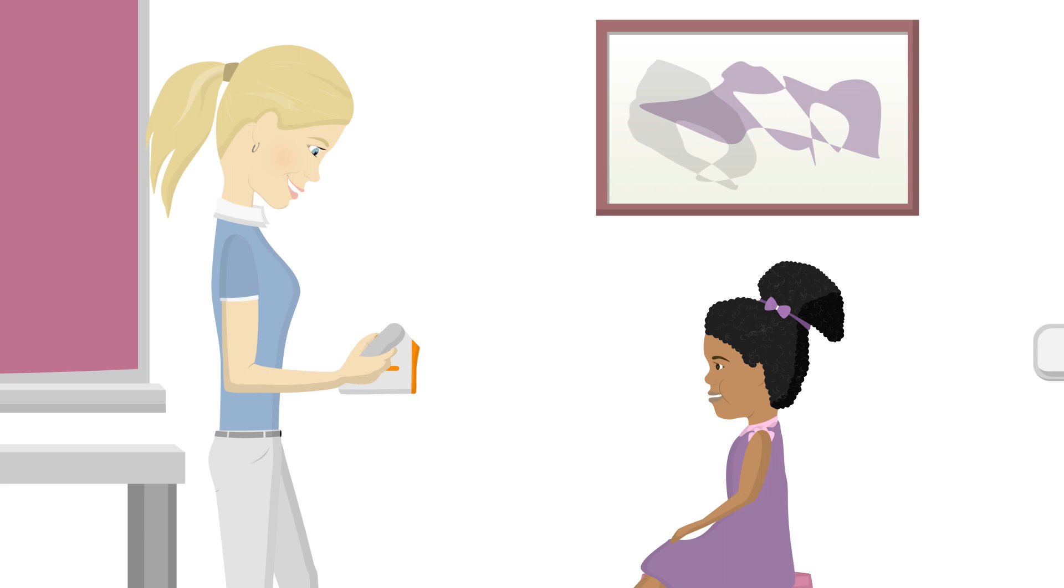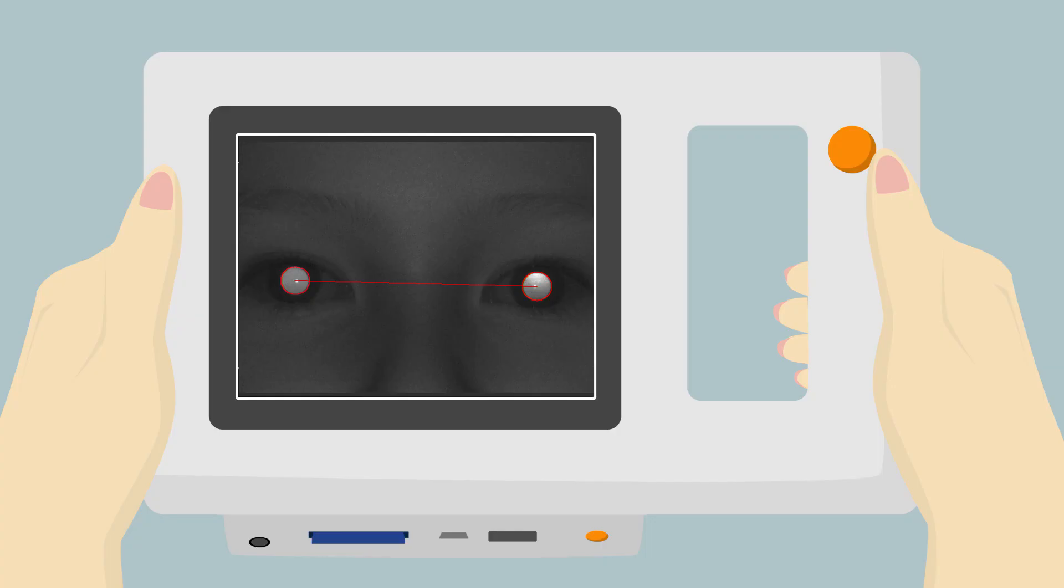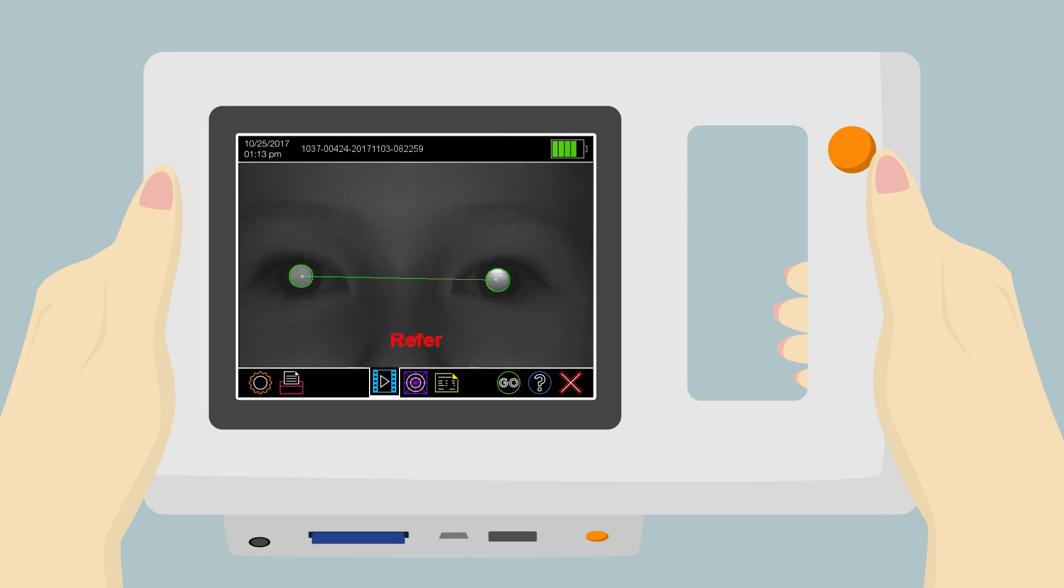Once Anna sees that each pupil is surrounded by a green circle, she needs to pause for just a moment. When this happens, another attention-grabbing warble sound will be emitted. A ping sound indicates the end of the measurement. The screening result, as well as the camera image, will appear on the screen.